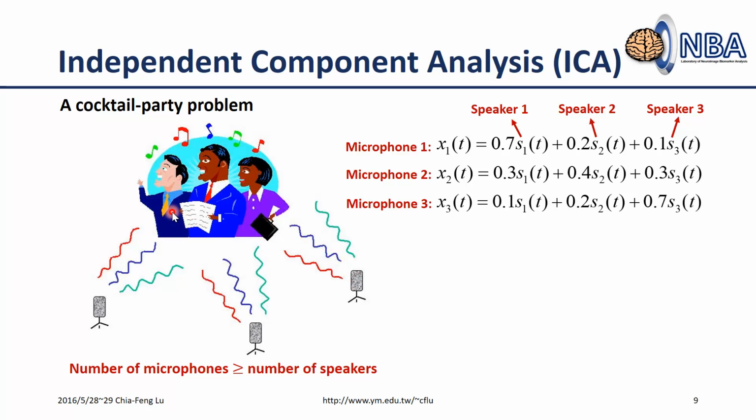So now what you can imagine is if I try to record the sound from these three different microphones, the weighting from different speakers would be very different. For this one, the largest sound or most clear sound is from this one. So the distance becomes one of the weightings in the mixed signal from these three different microphones.